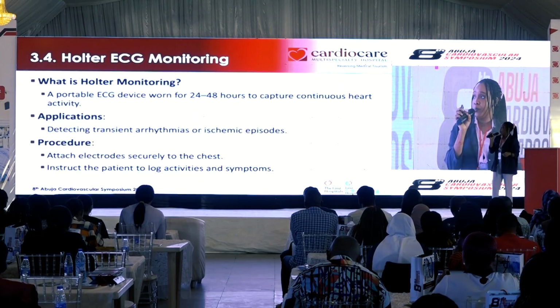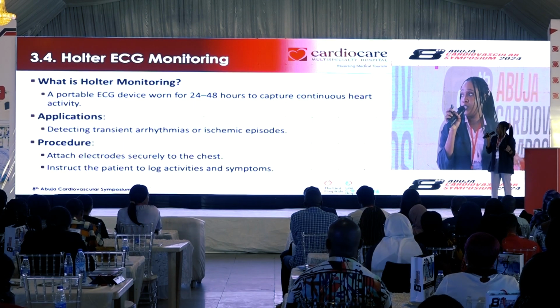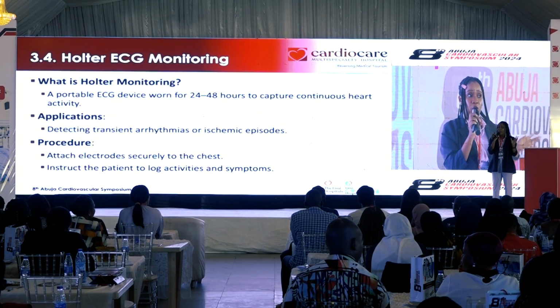Okay, so another procedure which we carry out is the Holter monitor. These are portable devices that the patients take home, which monitor the electrical activities for either 24 hours or 48 hours. Sometimes our ECG might not give you everything you need.